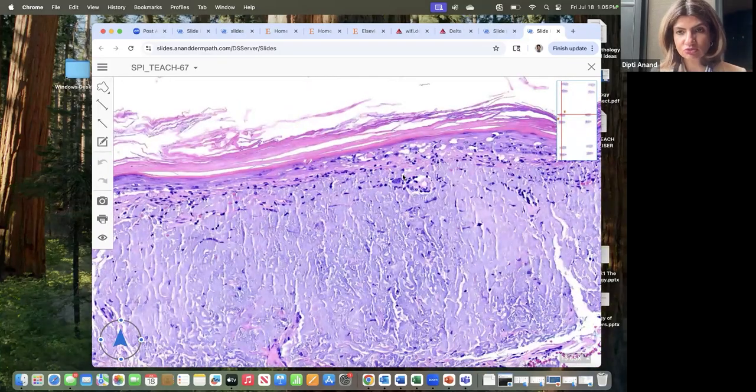So when you see this, you are in a connective tissue realm, which could be either lupus or dermatomyositis, and you really cannot tell apart lupus and dermatomyositis based on your slides, based on the histology. You have to be able to correlate it clinically and with serology studies.